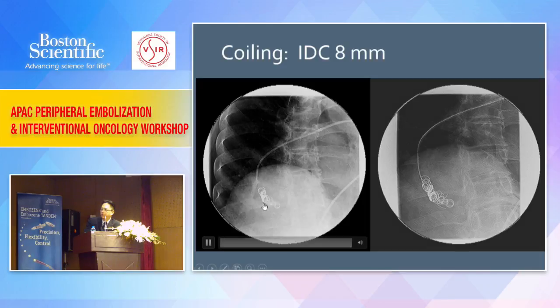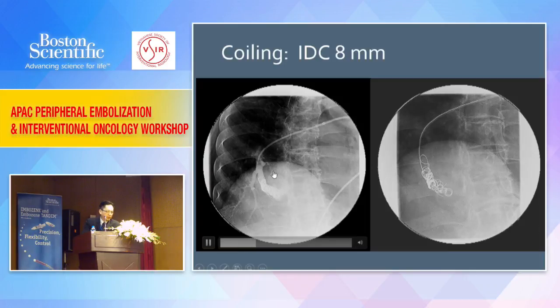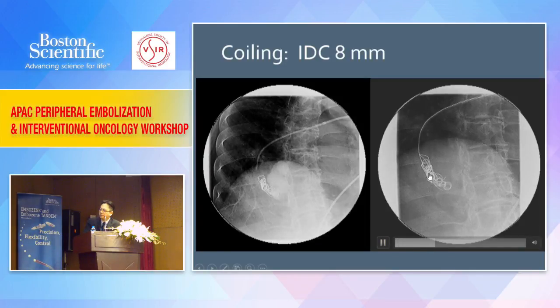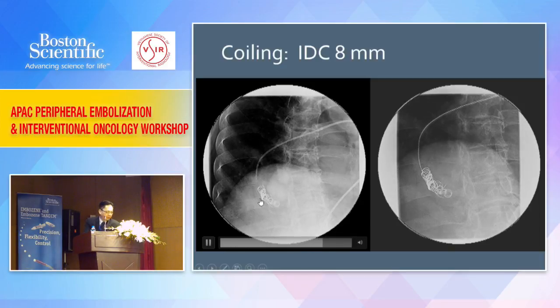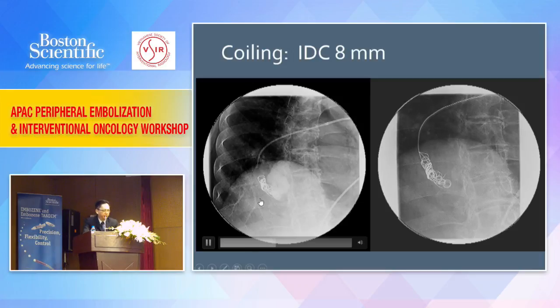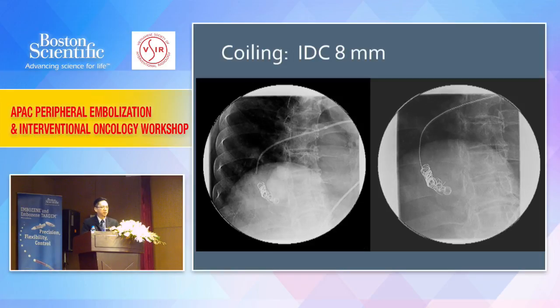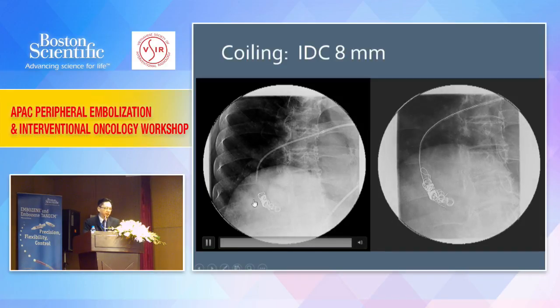In the second embolization, only 3 loose coils were inserted, I think, and because of that the primary principle of embolization of an AVM has already failed, because it was loose embolization without complete occlusion. I'll put aside the further recanalization after coil compaction.